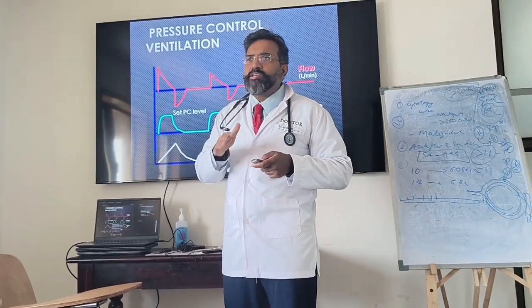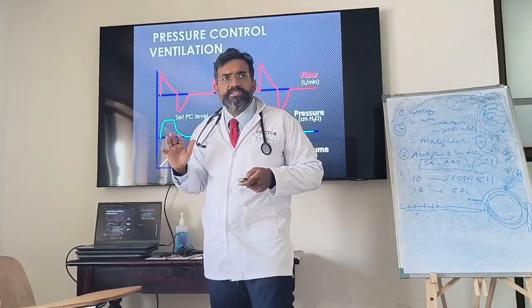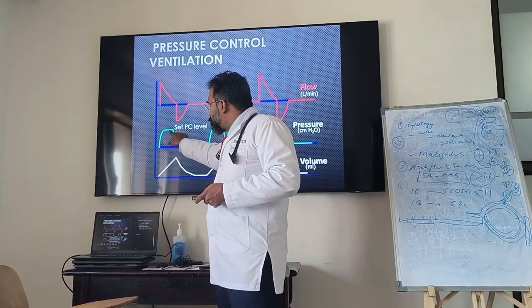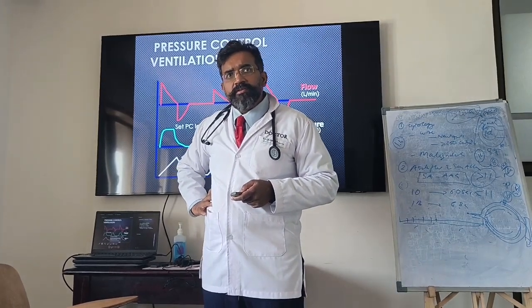Volume I am limited to a certain volume. I told the volume कि भाई 400 तक पहुंचो. But इसमें क्या बोला मैंने, 20 तक पहुंचो. I have reached till 20. So I limited it at 20 for example. So this limit is pressure. Clear?